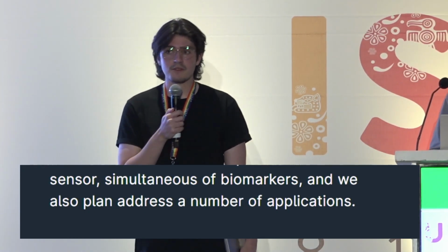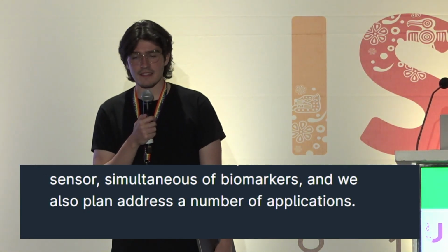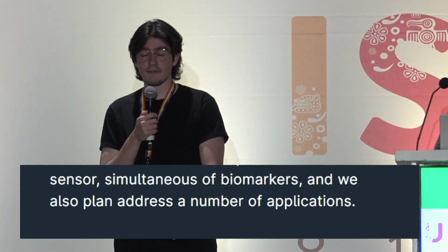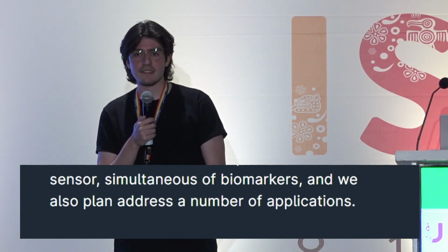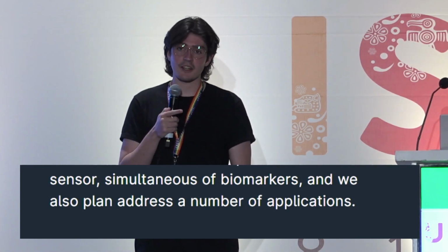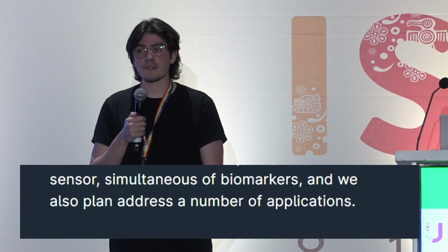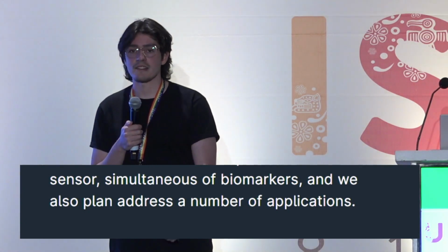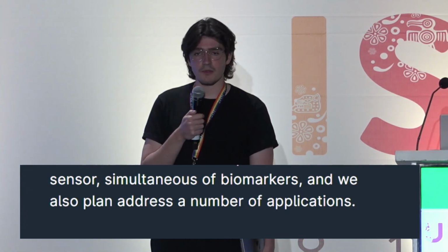Yeah, so we didn't conduct an ablation study on the actual size of the forehead itself, but just from experience looking at the data, we did find that the size of the forehead affected the model performance. Also the touch area sort of summarizes the size of the forehead in a way, because someone with a smaller, and also more rounded, curved forehead tends to make less contact, whereas a flatter forehead makes more contact. And so the hope is that the model is able to learn from those touch-based features to work across foreheads and generalize more. But yeah, you're right. Doing an ablation study with different types of foreheads would have also helped.